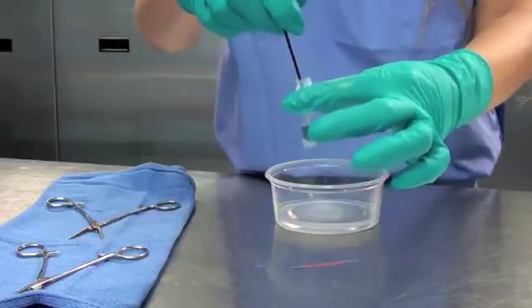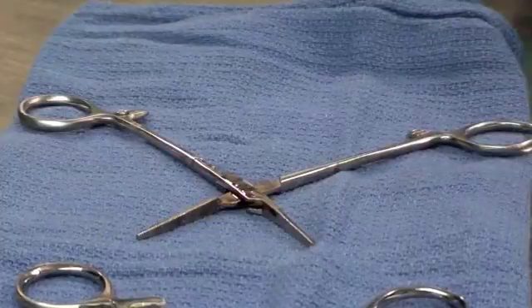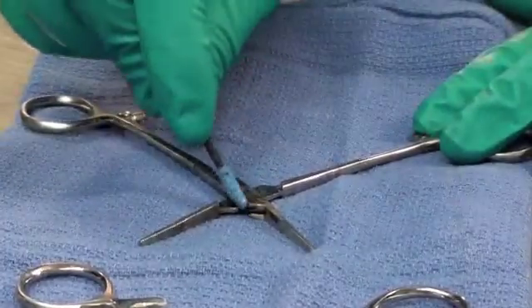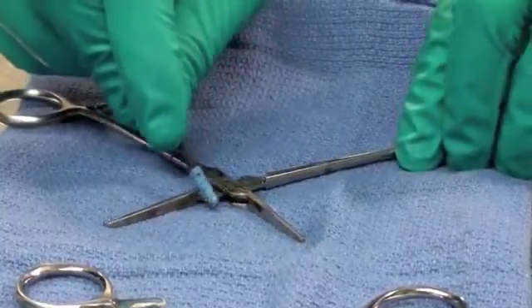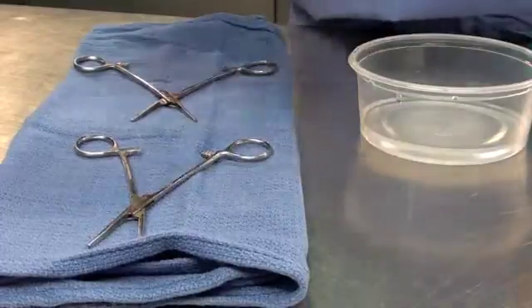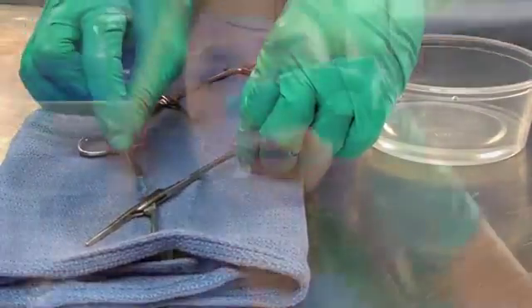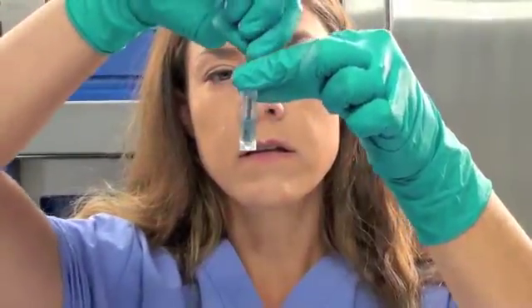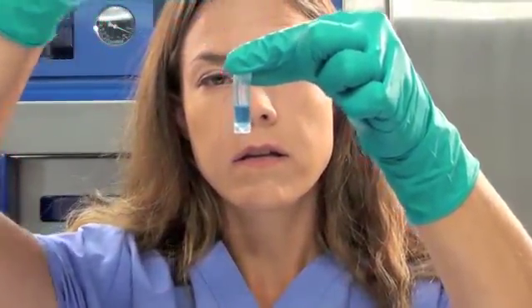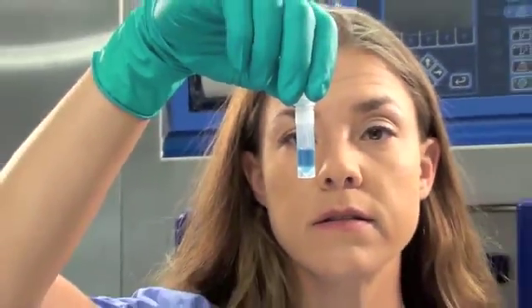Now that our control has shown a positive result, we will begin testing our instruments. If the object to be tested is already wet, vigorously swab the object focusing on the hinges or crevices as they are the most difficult areas to clean. If the object to be tested is dry, simply wet the swab with tap water before vigorously swabbing. Unscrew the cap and swirl the swab in the solution within the vial for a few seconds. Discard the swab and screw the cap back on the vial.